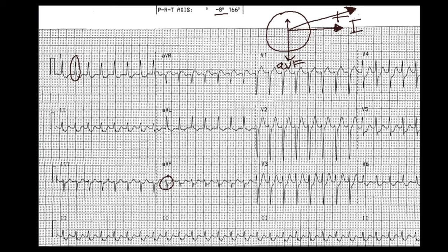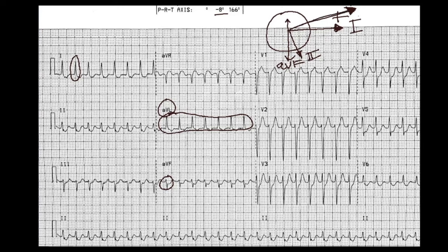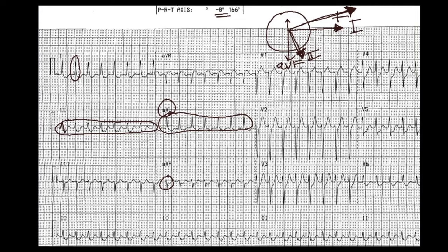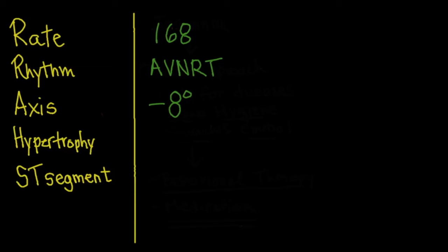At negative eight degrees, the vector is very close to being parallel with AVL, and you can see that AVL is one of the most positive leads. Ninety degrees perpendicular to AVL is lead II, so because the vector is going almost parallel to AVL, lead II should look isoelectric. Sure enough, lead II is isoelectric, confirming our ventricular axis is at negative eight degrees — a slight left axis.